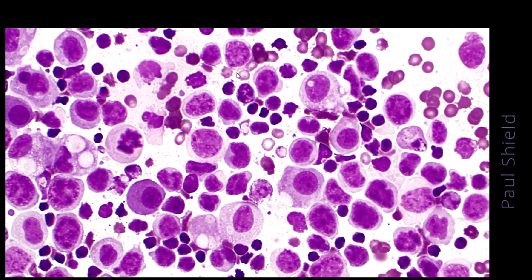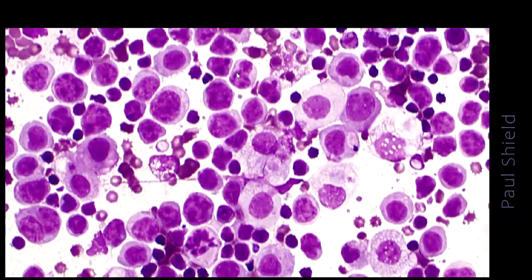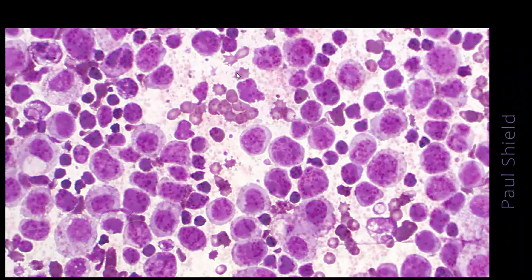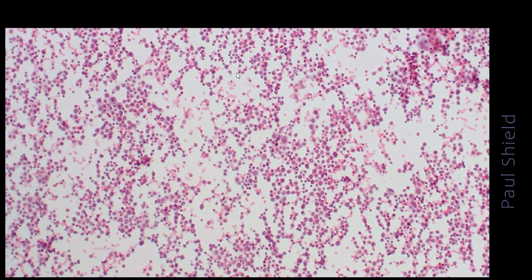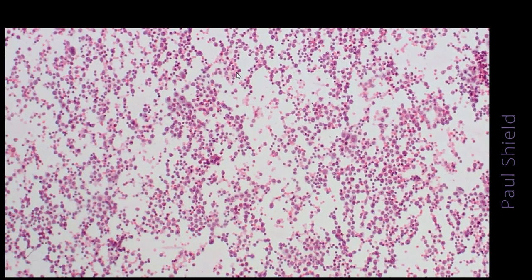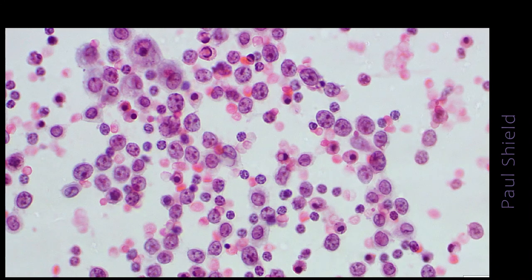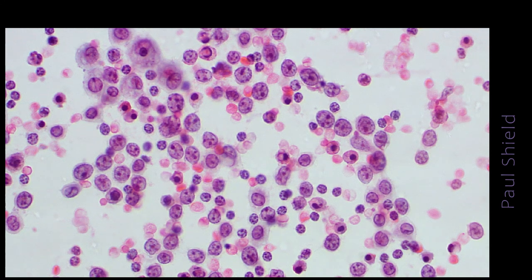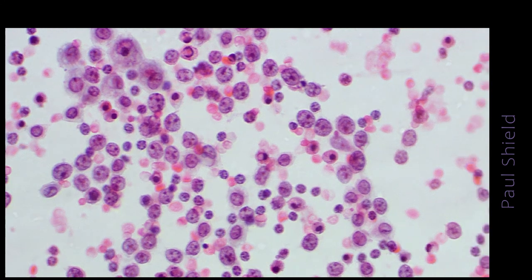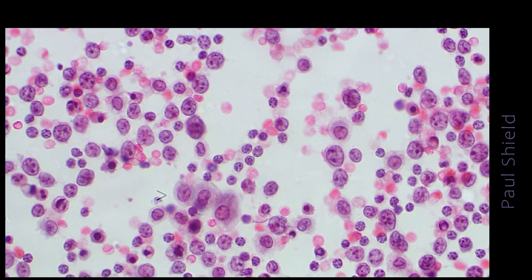And mixed through that are some mesothelial cells, just trying to find some. That's possibly a couple over there. This is the PAP, and as usual with lymphomas it's not as useful. But again, I can see a dispersed population, so that's reassuring for a lymphoma. The nuclei on high power have quite a lot of nucleoli, which is sort of a variable thing in lymphomas. There's some mesothelial cells there, some more down here.